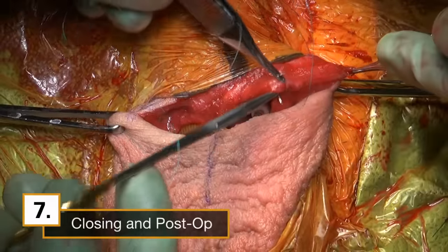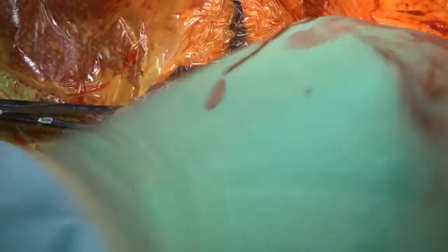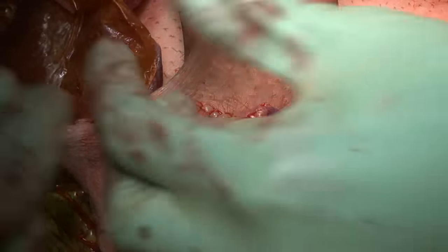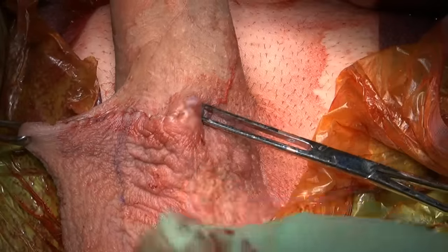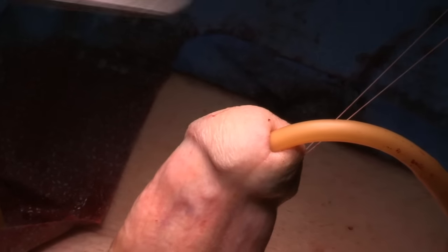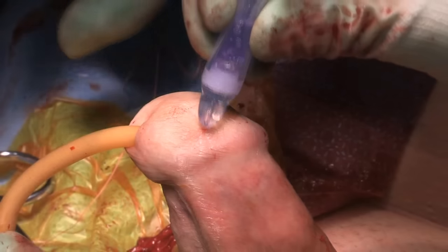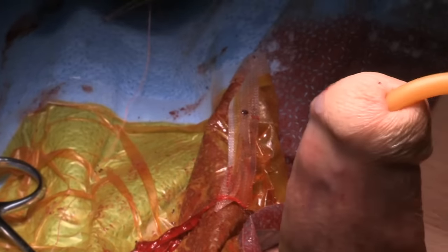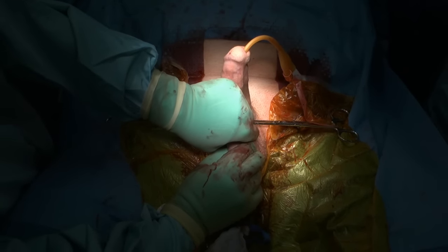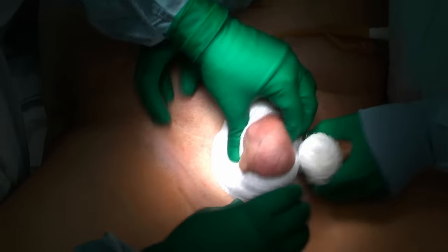I will close the incision in multiple layers. Then I remove the insertion sutures. We choose to apply Dermabond and then take a little fluid out of the device for patient comfort. However, I do leave the device partially inflated and then apply our final wrap to keep the penis up on the abdomen and the scrotum compressed.